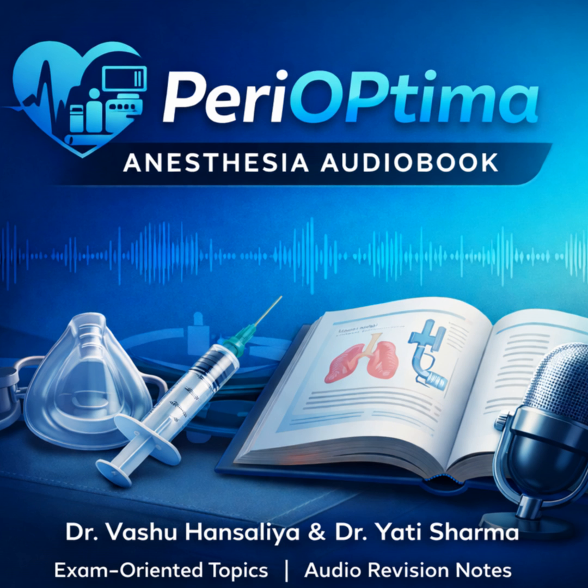Correct. And CO2 removal is dependent on the sweep gas flow. The sweep gas is the fresh oxygen or air flowing across the membrane oxygenator. CO2 diffuses incredibly easily, much, much faster than oxygen. So if you turn up the sweep gas flow, which is like turning up the wind blowing across the blood, you blow off more CO2. And critically, this is independent of the blood flow rate.